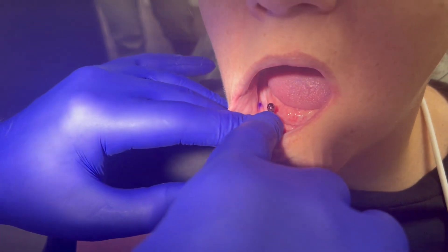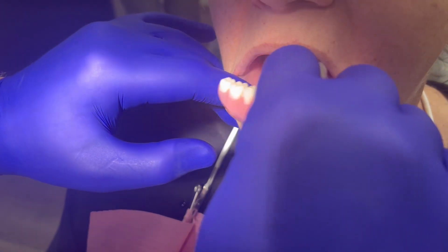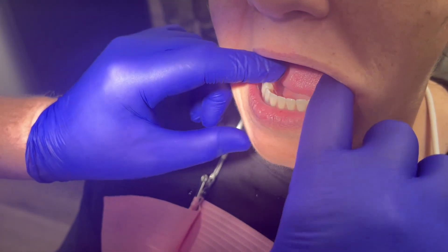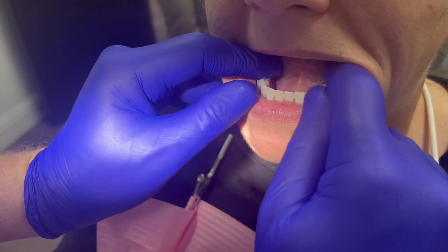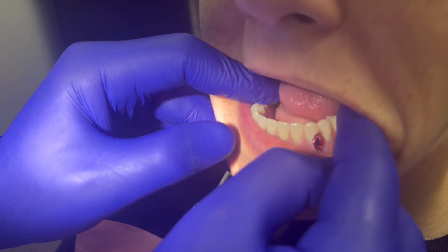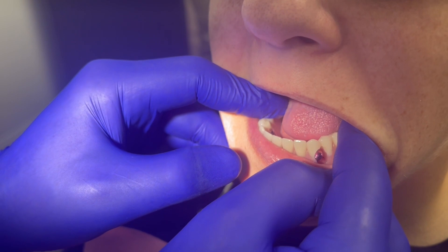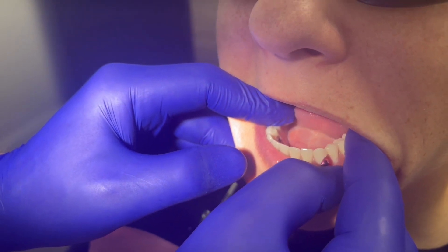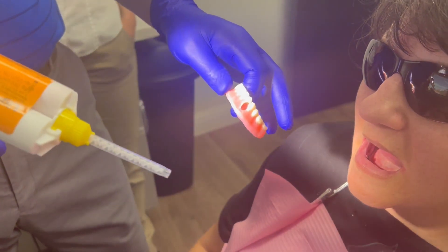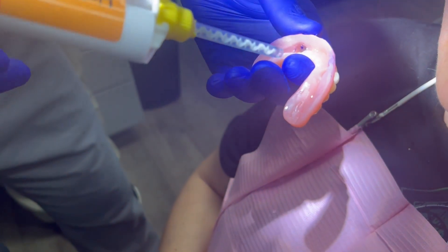Now you can see I have both locators there, and you can see that the implants are sticking up just a tiny bit — that's expected with slightly older implants that have some recession. But when I place the denture in, you can see that it fits. Some of those implants are going to fit a little bit toward the cheek, and I've made the patient aware there's going to be a small pink bubble of material to encase that housing.